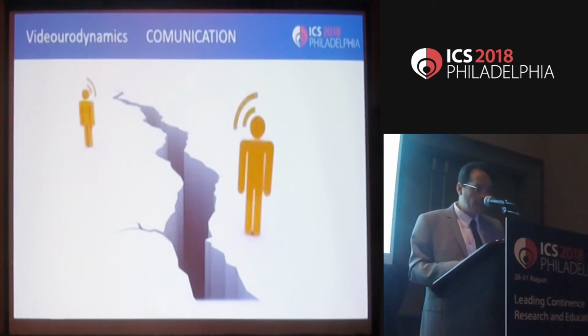When all is set up and the position is right and everything is going well, you have another problem, and it's the communication with the patient. Sometimes the patient has no possibility to talk because, for example, of a stroke, and you have to communicate with signs, which is not a problem.